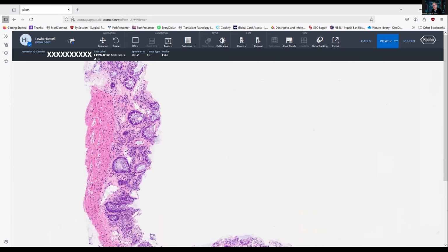So this can be a somewhat subtle microscopic finding and one that you need to be aware of and be alerted to by virtue of the history.